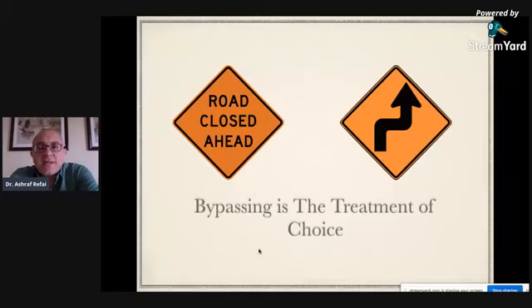When a dentist or an endodontist has an instrument which is fractured inside the canal, and he's taken an intraoperative X-ray and he sees that instrument, his most wanted wish is for this instrument to be removed and taken out of that X-ray. So bypassing is usually not something that the doctor wants to do. He would prefer to remove it.